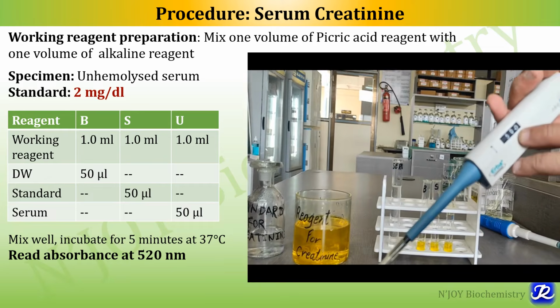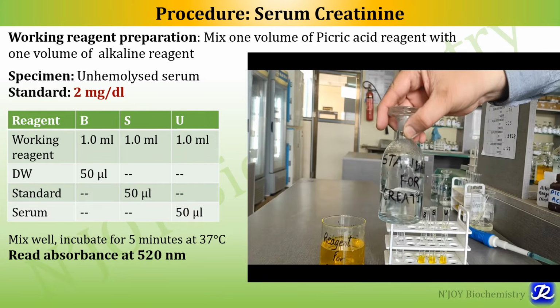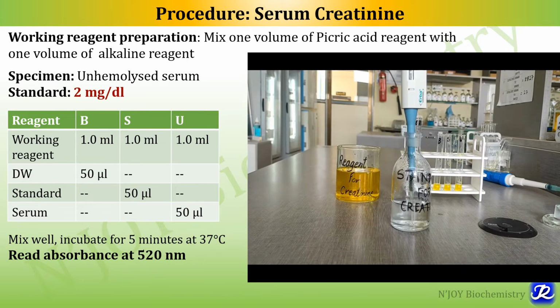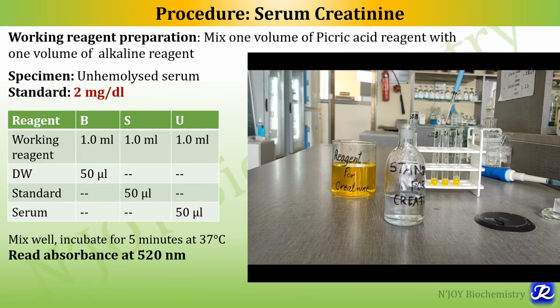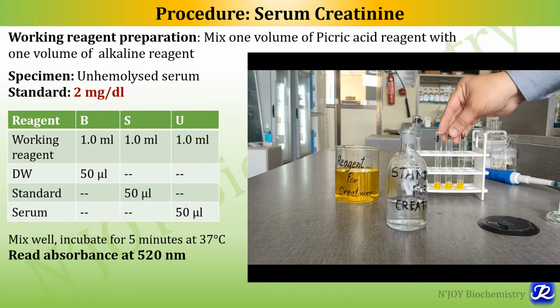Then we will take 50 microliter micropipette. First we will add standard for creatinine in the standard test tube, that is 50 microliter of standard in the standard test tube. Mix it well.